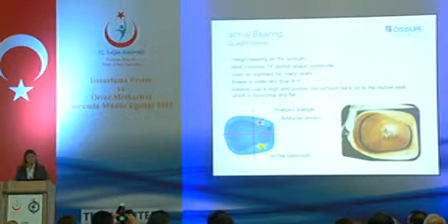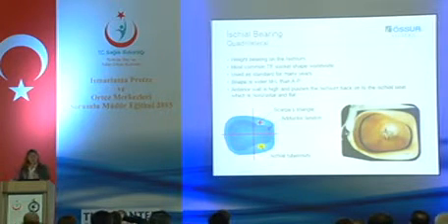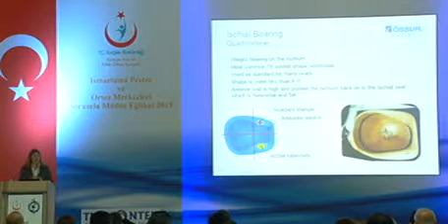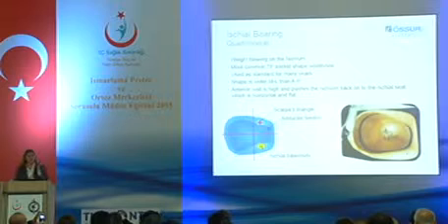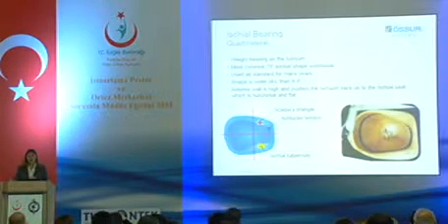The shape of it is wider medial laterally than it is anterior posteriorly, and what we use is the anterior wall. We tend to make that higher to push back the ischium onto the seating.